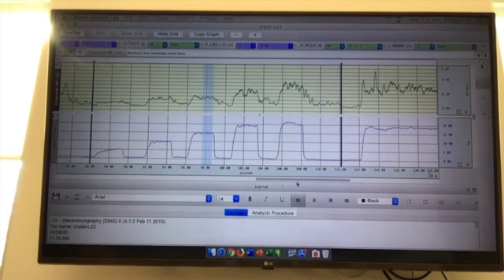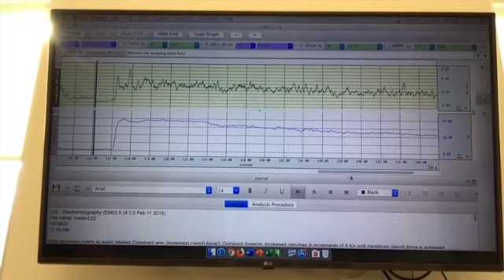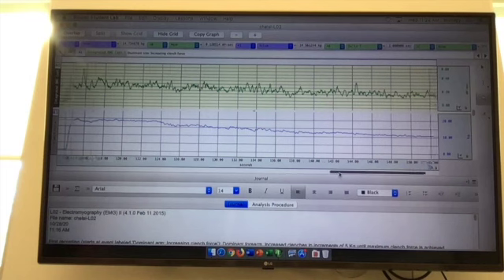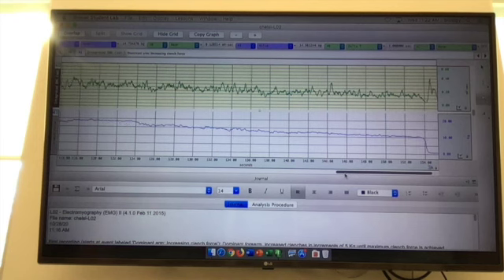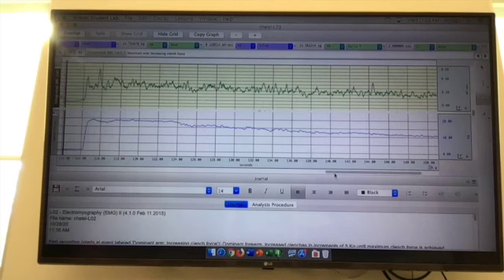And then, okay, for the fatigue exercise, we want to see how long it takes to get to fatigue, or 50% of our force, the amount of time. So if we want to know the amount of time that it takes to get fatigue, we want to be able to highlight the entire thing.